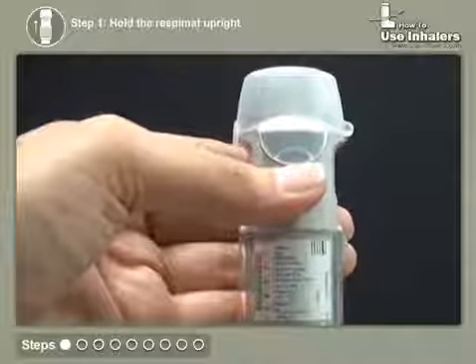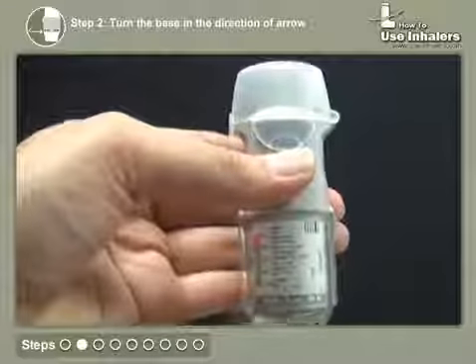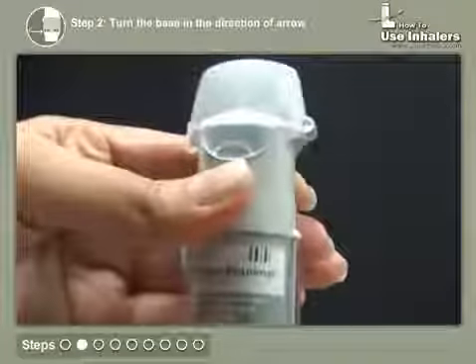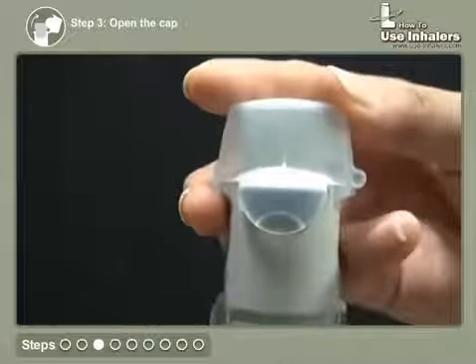Hold the inhaler upright. Turn the transparent base in the direction of the arrow until you hear a click. Open the cap till it snaps in place.